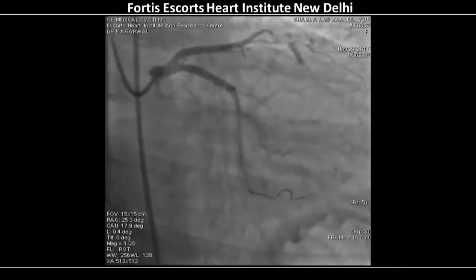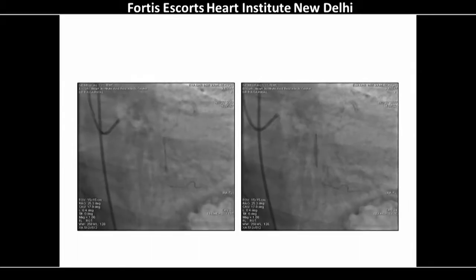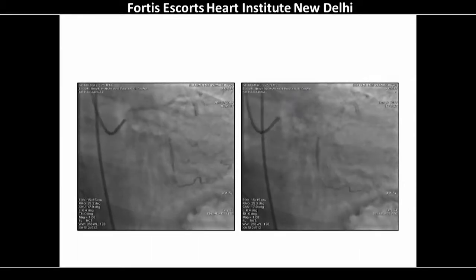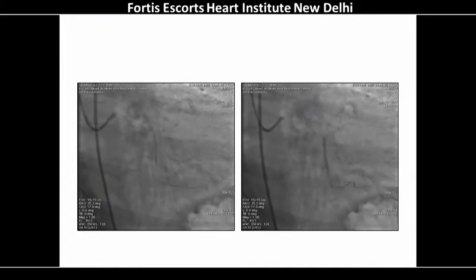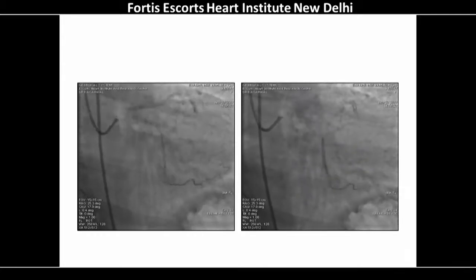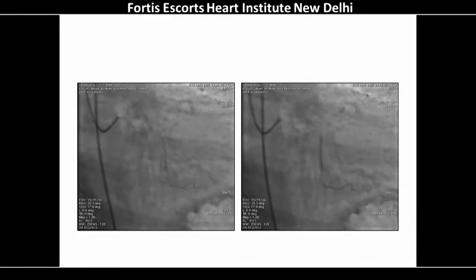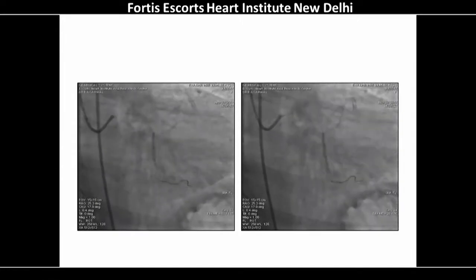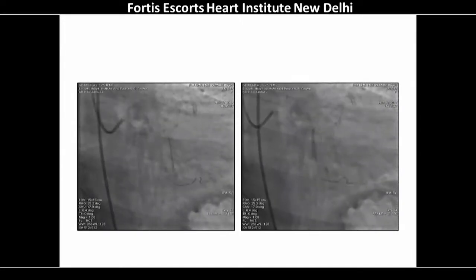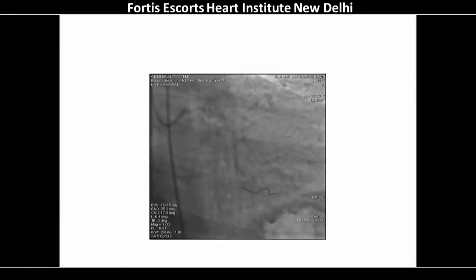It was a 2 into 18 millimeter stent, deployed at reasonably high pressures. It was not covering the full stent which was put previously in 2007. Then a high pressure dilatation was done, taking a 2.25 balloon. And it was a reasonable kind of result at that time.